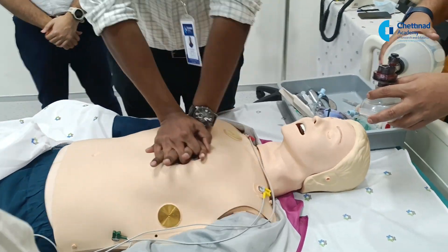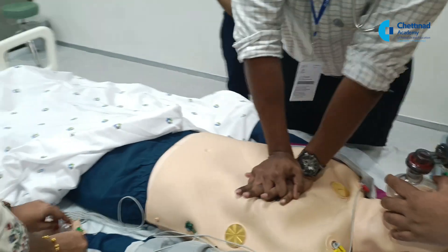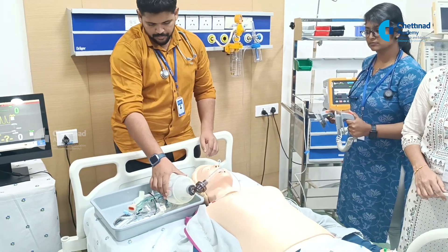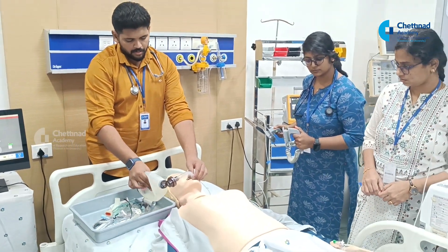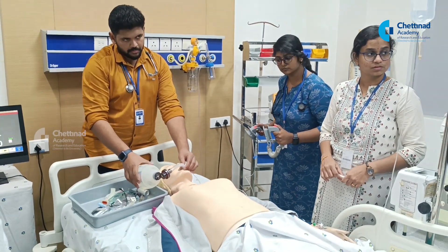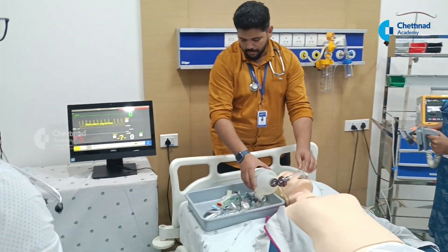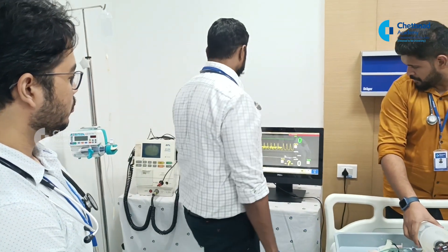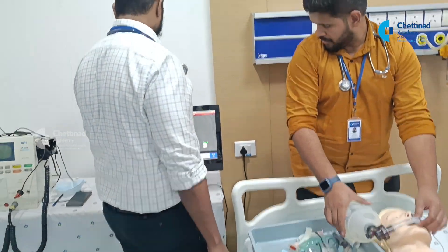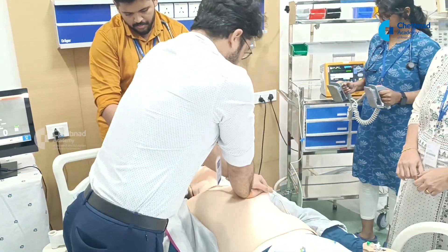Okay, can you charge the defibrillator, Dr. Krishna? Charge the defibrillator? Yes. Has it gone into paddle mode? No. Can you increase the gains, Dr. Vinay? Venkat, can you increase the gains and see? No, it is asystole. Continue CPR. Don't give the shock. Continue CPR. Don't give the shock.